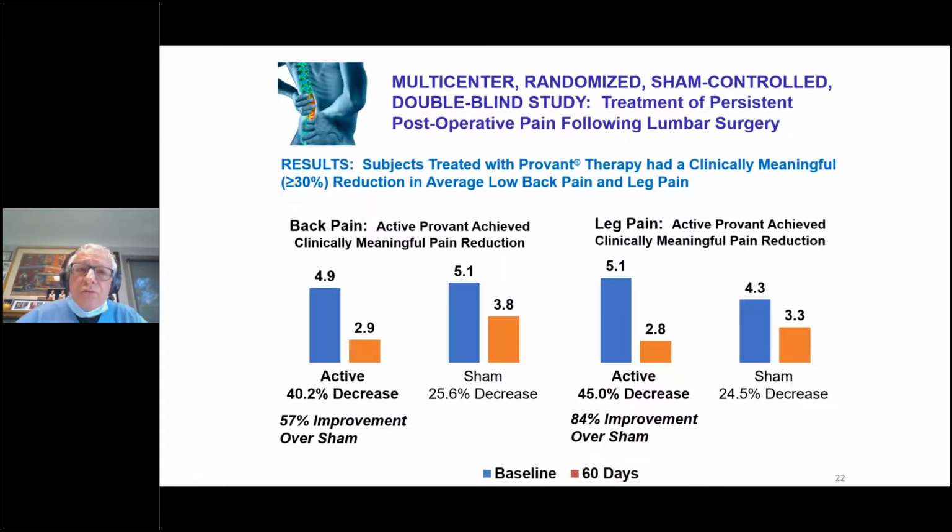Another study, this one was randomized, sham-controlled, and double-blinded by Sorrell et al., published in 2018, compared three groups, and again, including a sham, and that's important, I think. So there was a sham group, a 42 microsecond, again, that pulse width group, so the 42 group, and a 38 microsecond pulse group. And you're probably wondering, okay, why? Well, this is going to be important in a slide or two. Let me get back to that. So again, a sham, a 42 and a 38 microsecond group.